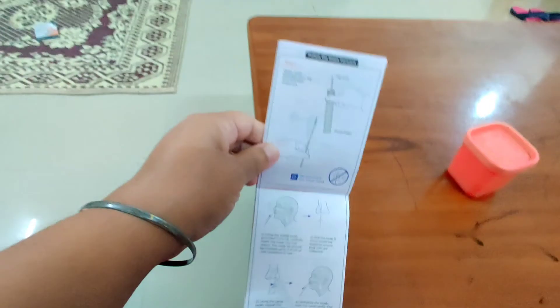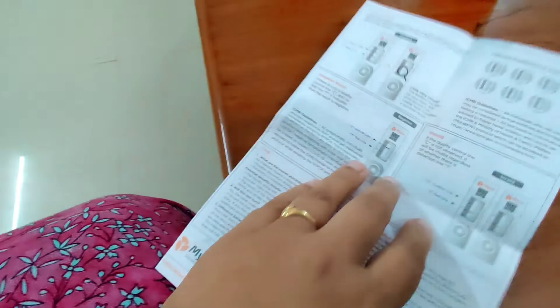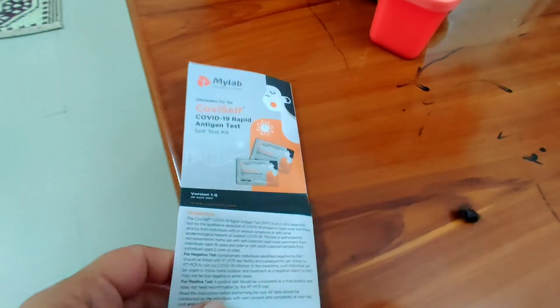This is the manual book — it has all the details written in it. You have to read it again so that you know how to do it properly. You can easily do this test at home.